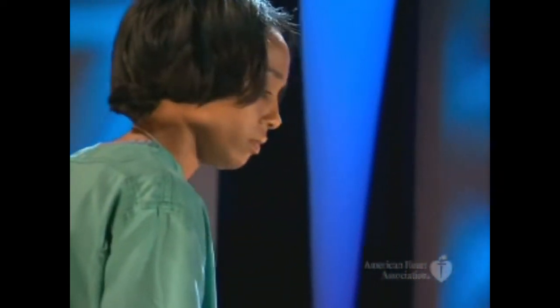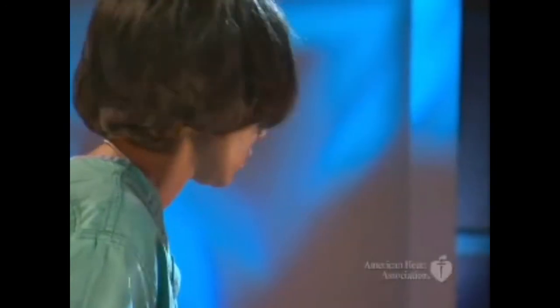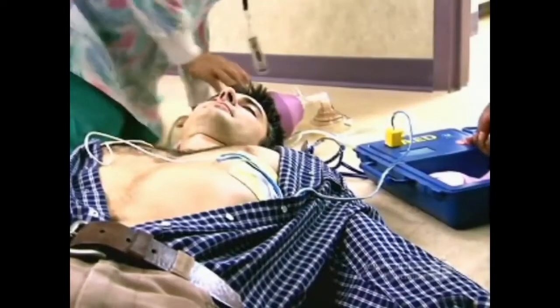If the AED finds a heart rhythm that can be treated with a shock, the AED will tell you so. Shock advised. Stay clear of patient. Deliver shock now. The AED will then tell you when to push the shock button. I'm clear, you're clear. Clear. We're all clear. When the shock is delivered, the victim's muscles will jerk.